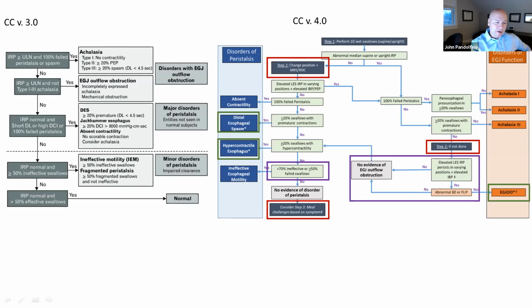I also think I was very happy with the introduction of thinking about things outside of just the manometric procedure and thinking about the other clinical aspects of the case. And I think endoscopy is something that we will need to think about in terms of our pre-test probability, because there are people who have talked long about this. And Alan Cameron is someone from the Mayo Clinic. I still have his paper up in my office, where he talks about diagnosing motility with endoscopy. And I think endoscopy has a lot to add to the evaluation of motility. And I think Alan brought that out over 20 years ago. And I think we need to bring all of this information together to get to the best diagnosis. And I think that's the end result for the Chicago classification.